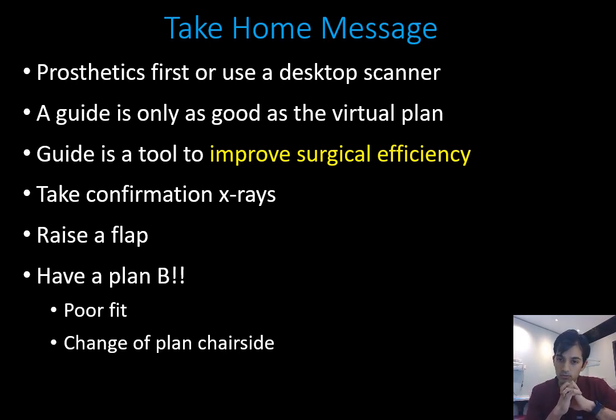Thirdly, a guide is just a tool to improve your surgical efficiency. There are times where guides may not fit. Most errors come at the time of 3D printing chairside. Those of you who are going to do this in-house, you're introducing external factors such as excessive curing of your prints, incorrect autoclave cycles. It's usually errors related to the printing process, not the planning software or the design itself.